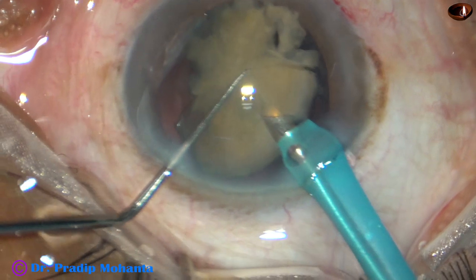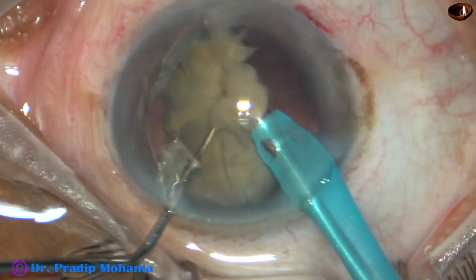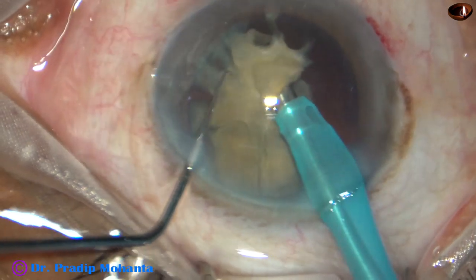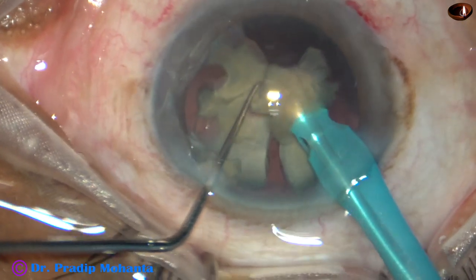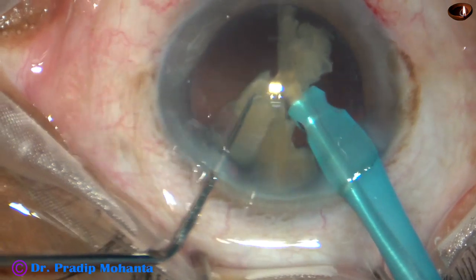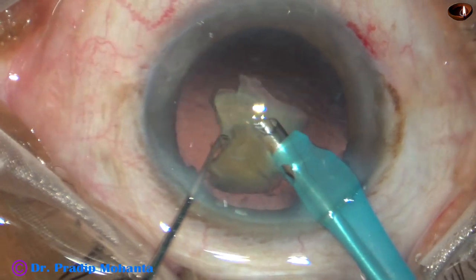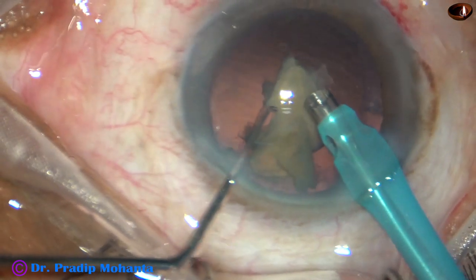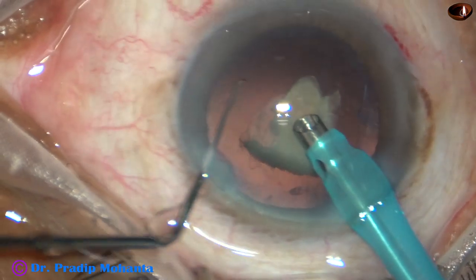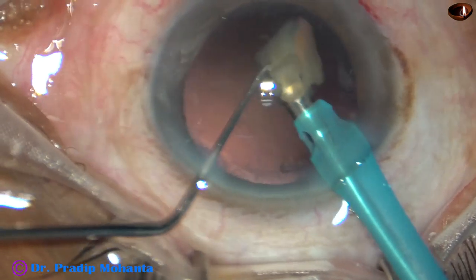I have flipped this nucleus and I am emulsifying it from this side. I hold this and emulsify this part. If you flip the nucleus, it becomes very easy to divide it into fragments.